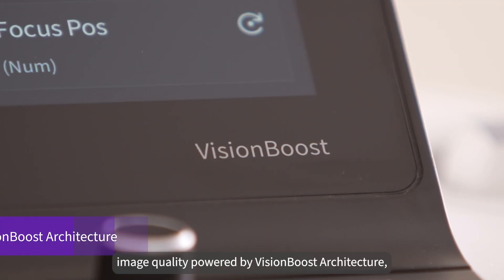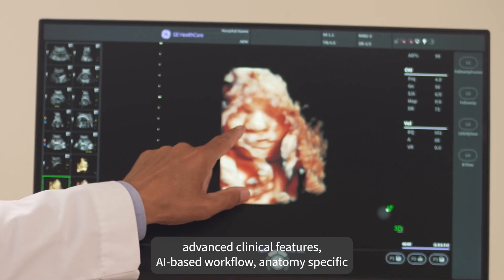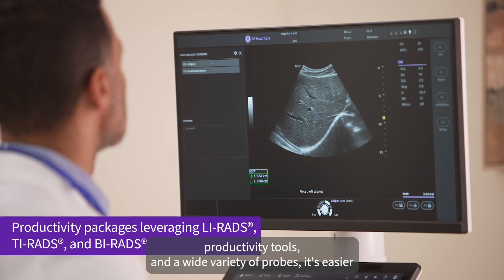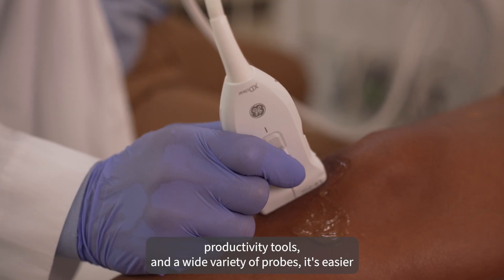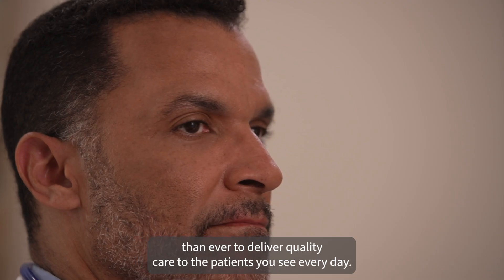With world-class image quality powered by Vision Boost architecture, advanced clinical features, AI-based workflow, anatomy-specific productivity tools, and a wide variety of probes, it's easier than ever to deliver quality care to the patients you see every day.